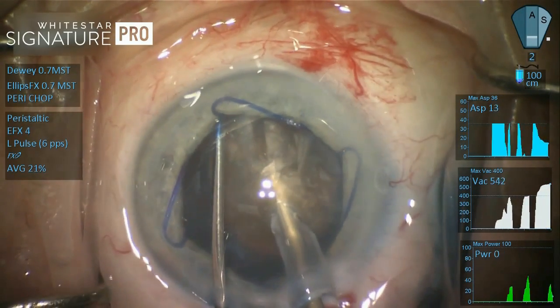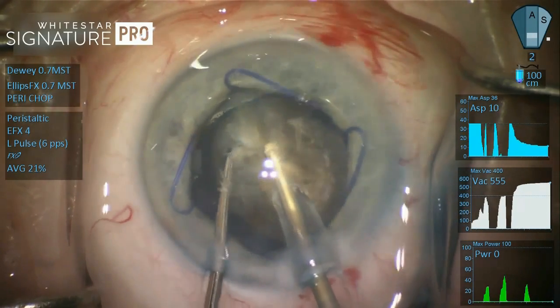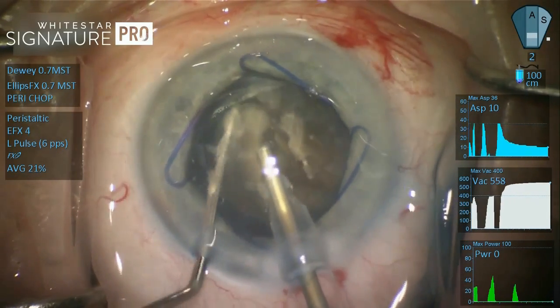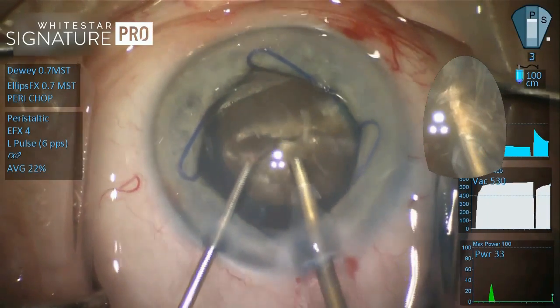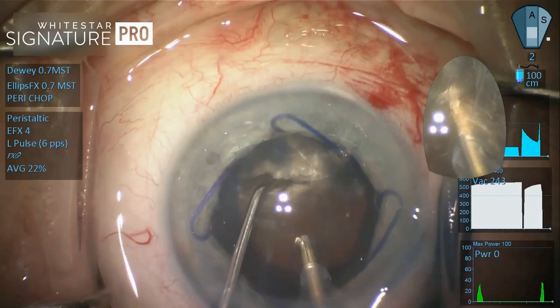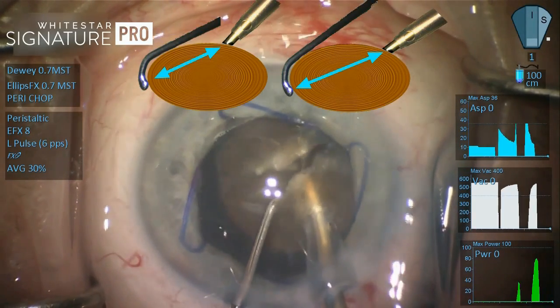The nucleus really kind of brought itself onto the needle, and I'm looking back at the settings, and it was 550 of vacuum, which explains it tremendously. So here we are looking at how the irrigation sleeve will stop the forward progress of the needle, so you don't have to worry about going all the way through.